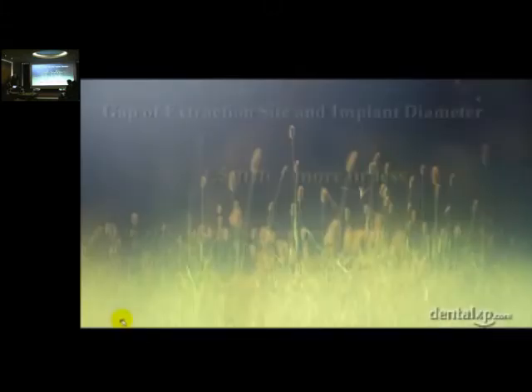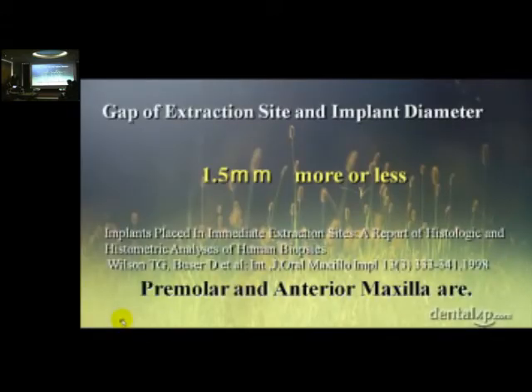Secondly, Dr. Wilson and Dr. Botticelli reported that if the gap between the extraction site and implant diameter is smaller than 1.5 mm, it is predictable without bone graft. In my criteria, molars are not indicated for immediate implant placement, but premolar and anterior teeth are.